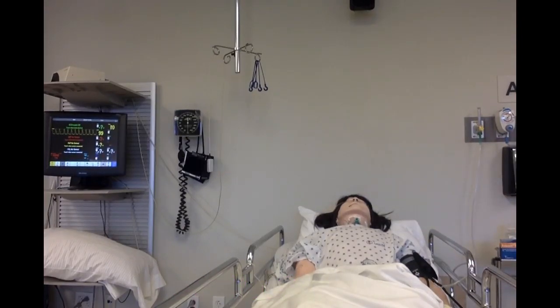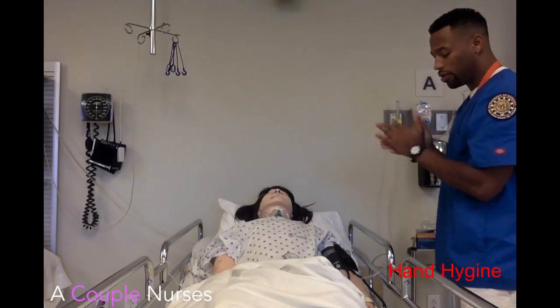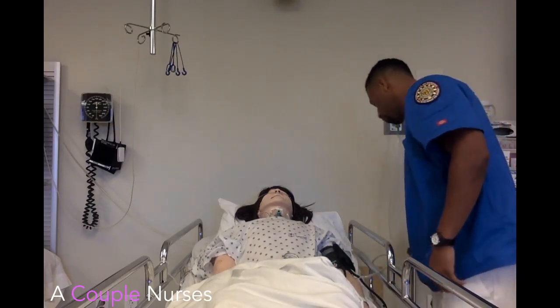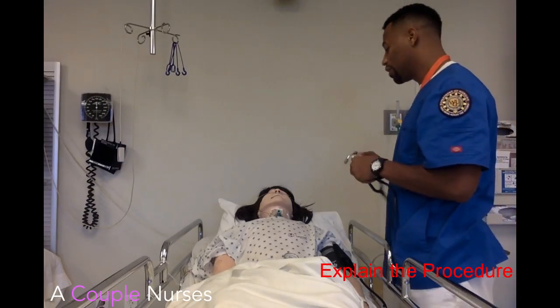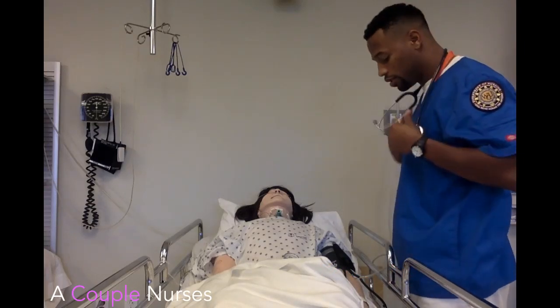How you doing? My name is Cord, I'm going to be your nurse today. How are you feeling right now? Okay, confirm your name and date of birth please. All right, thank you. So the doctor's orders for us to do some inline suctioning, so we're going to get your tracheostomy suctioned down and do a little trick here to clean it up. Before we get started let me go ahead and get some of your vital signs.